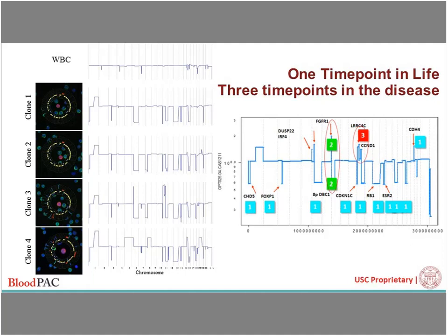So we propose that subclone 1 is the earliest CTC subclone, based on the observation that it exhibits the least CNV. Then based on subclone 1, 2 more deletions in chromosome 8p and chromosome 18p were observed. Then from there, 2 more amplifications in chromosome 6p and 11p were observed in clone 3.